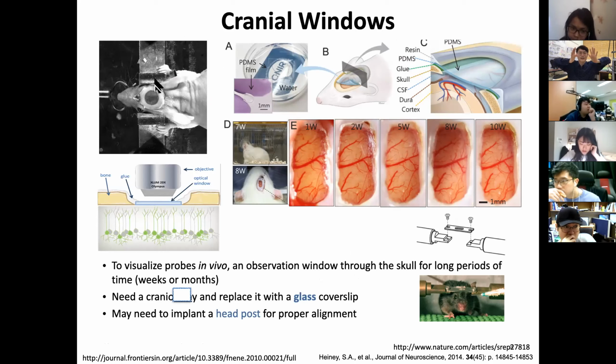There's just this L shape. You just put it under the animal, and I put some sponge here so that it maybe reduces pain for the animal. But you have to adjust the tilt by hand, with the tooth bar here. With a stereotaxic device, you sometimes need better control. Making this window flat is actually very challenging.